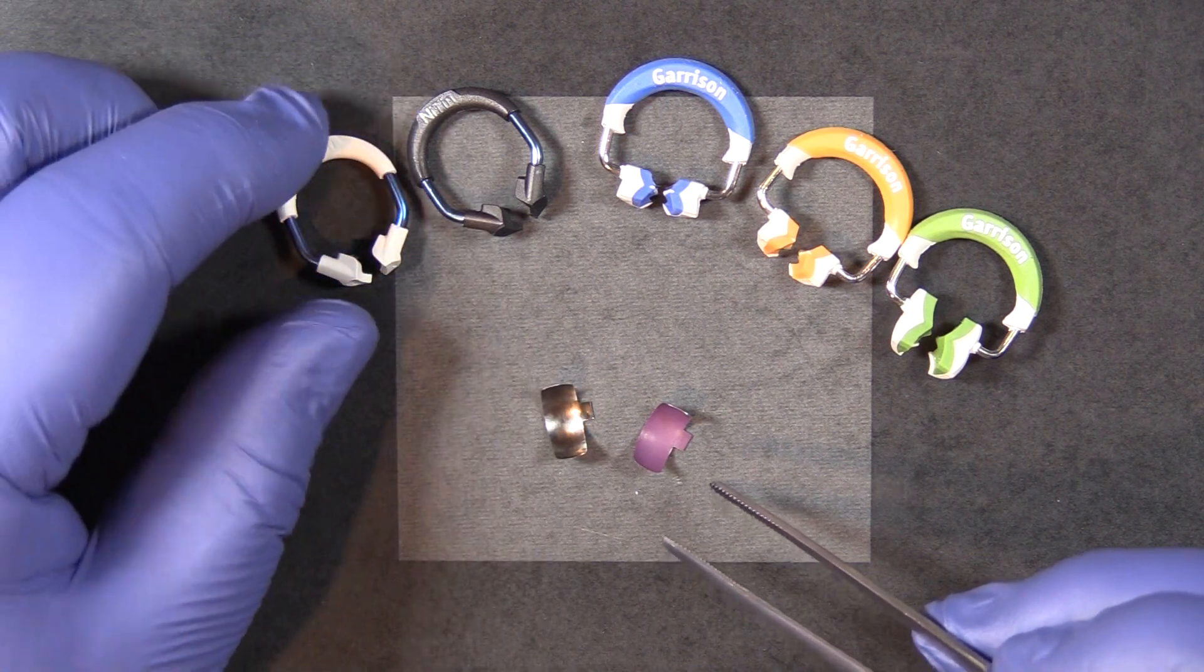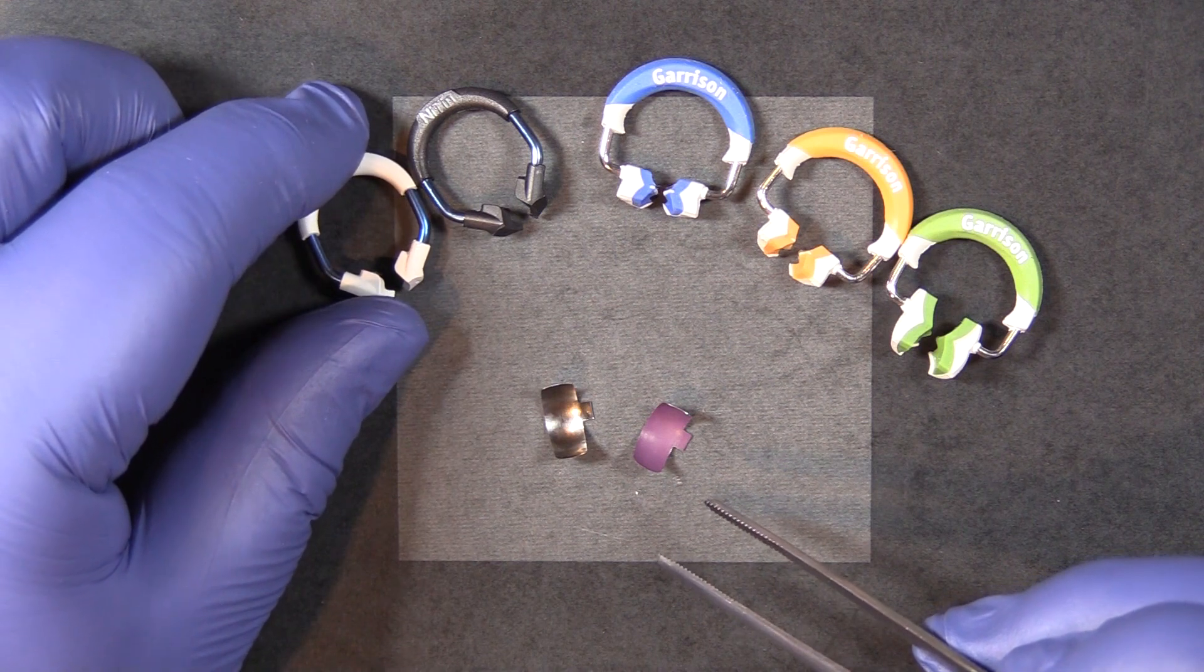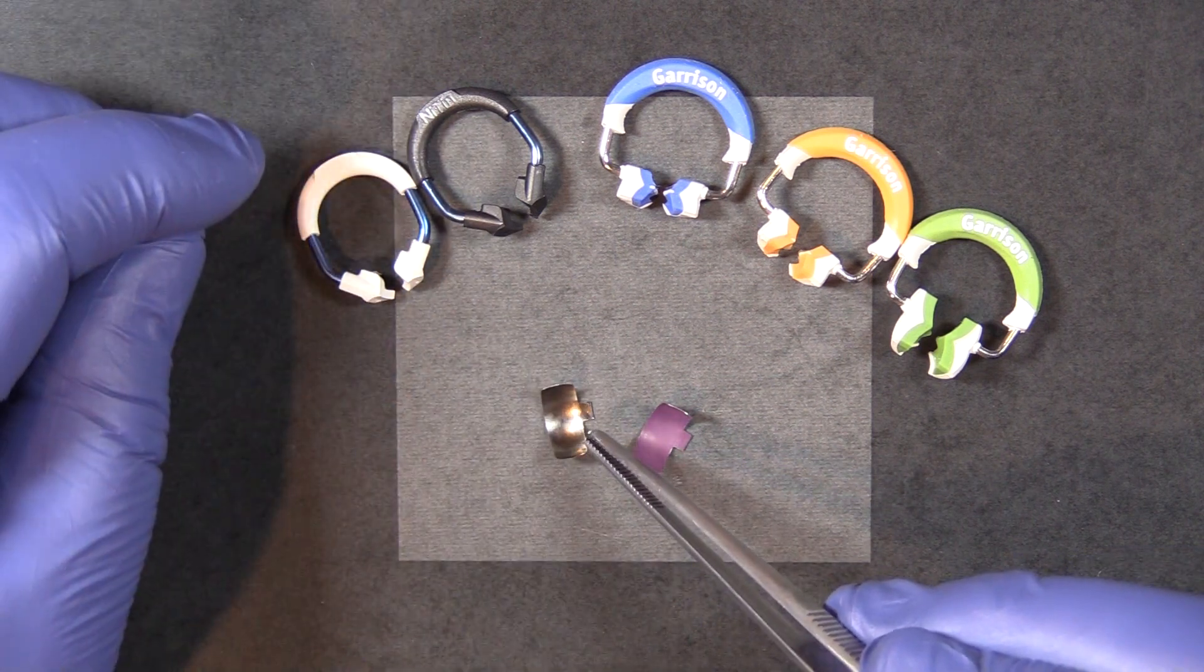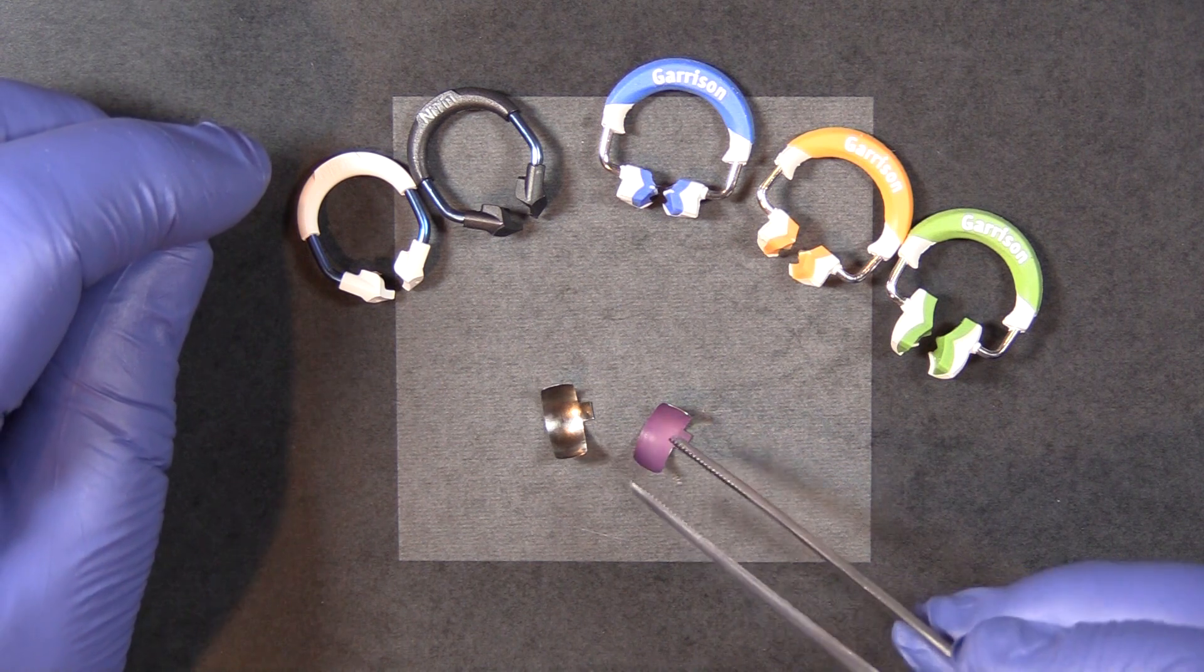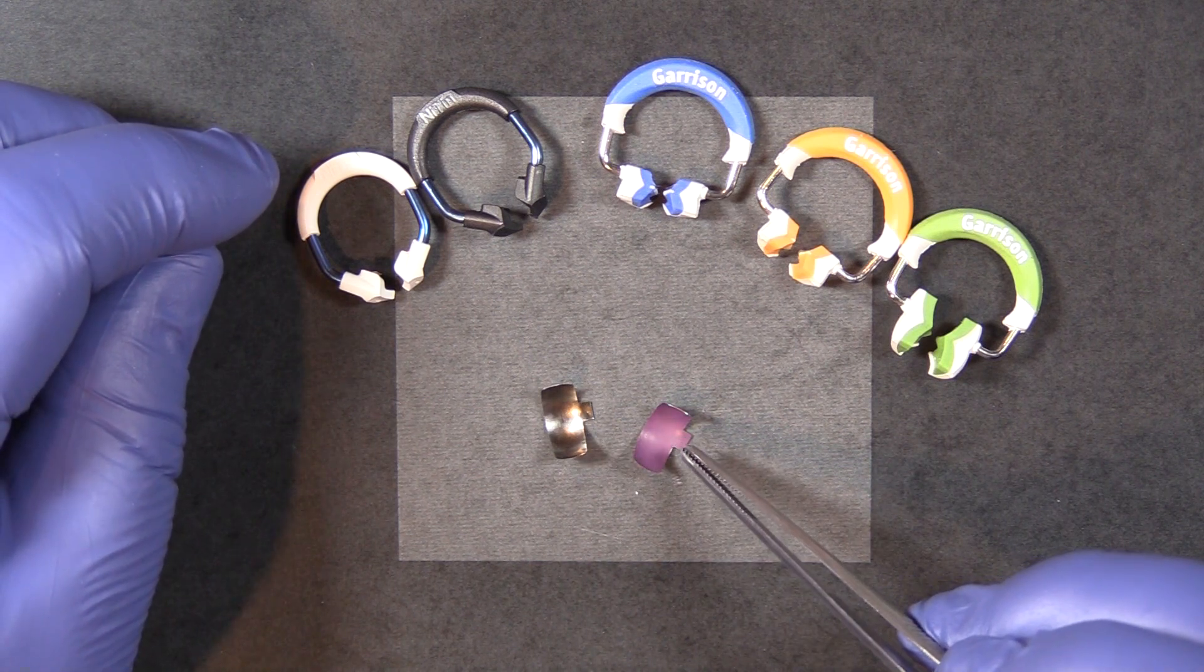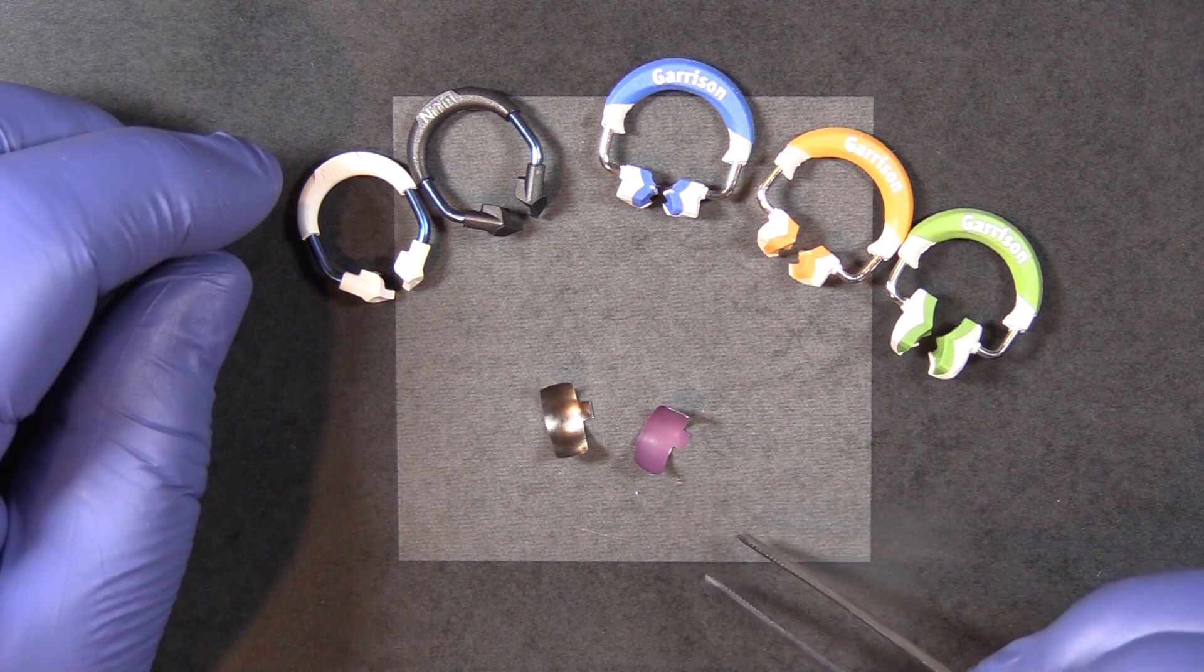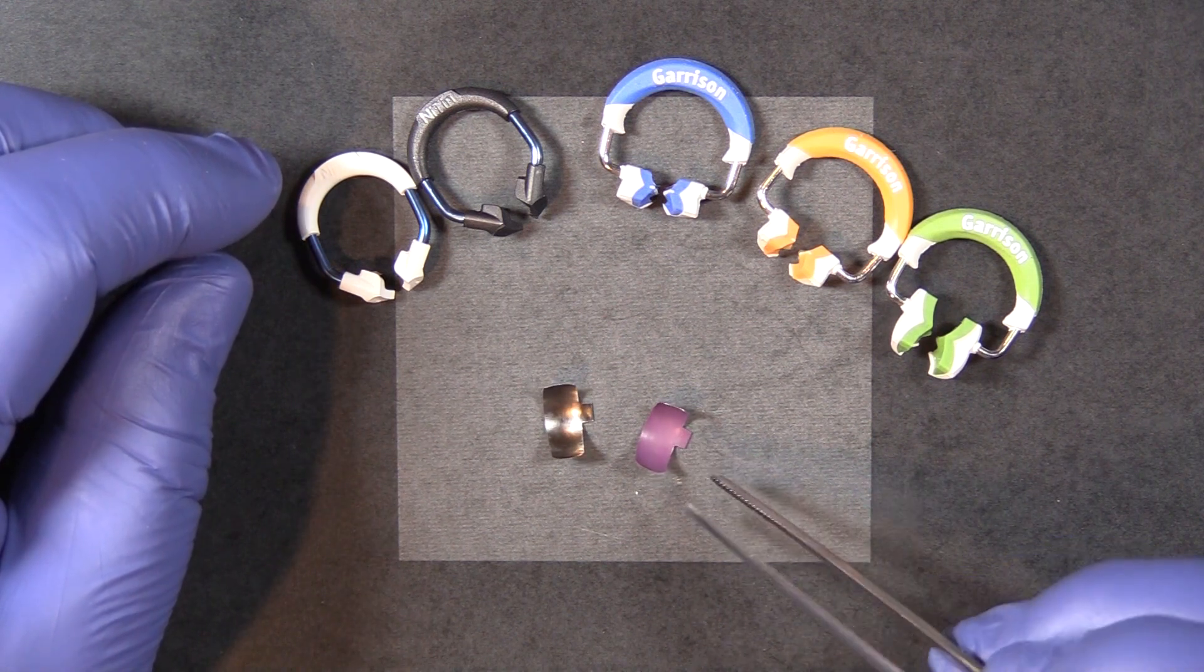If you do not have an issue with your particular brand of bonding agent adhering to the metal, then the Nitin bands are not going to pose any issue for you. If you're using a type of bonding agent that does aggressively bond to metal, then the Fusion bands will prevent gluing the band in the approximal.